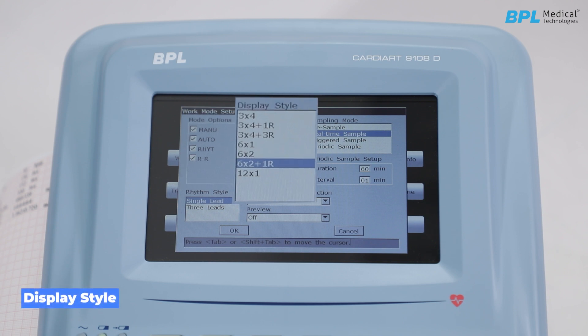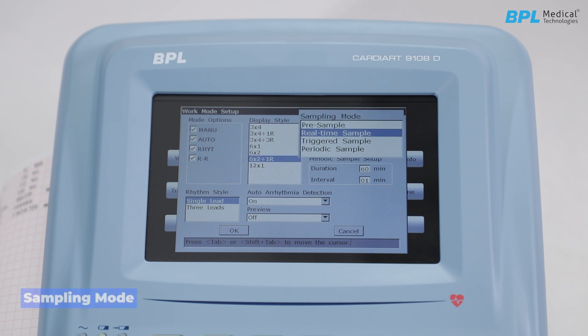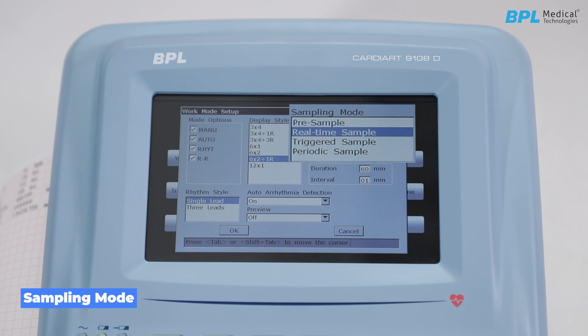Next is the display style, which is the format of the ECG waveform configured on the display screen. For sampling mode, there are four options: Pre-sample mode prints 10-second ECG data sampled before the trigger; Real-time sample prints live data; Triggered sample prints only when a trigger or deviation in waveform is captured; and Periodic sample allows ECG of required duration and interval to be printed.